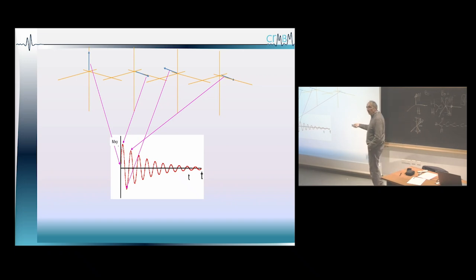And this is what you can draw if you link all the points in here. Up and down, and the intensity is going down. And this is the NMR signal in here. This is the change of the magnetization in the XY plane, okay, which is going from the maximum value to 0 according to this type of oscillation.